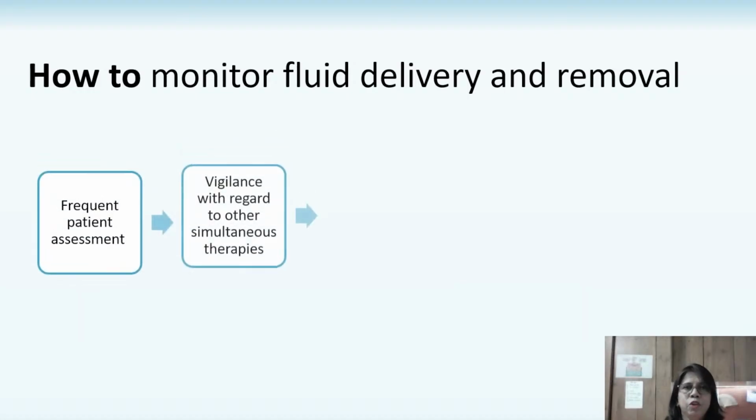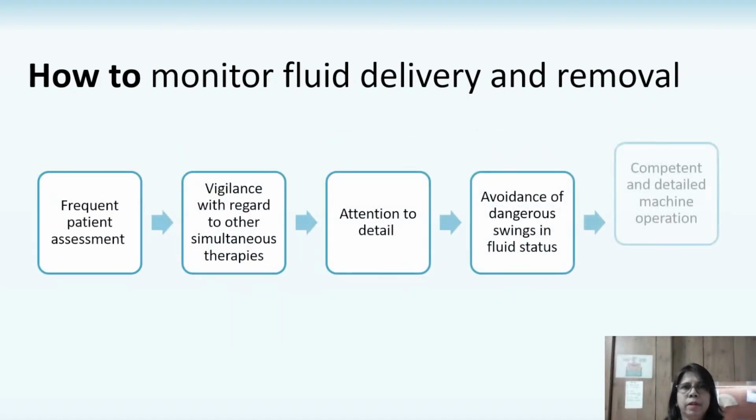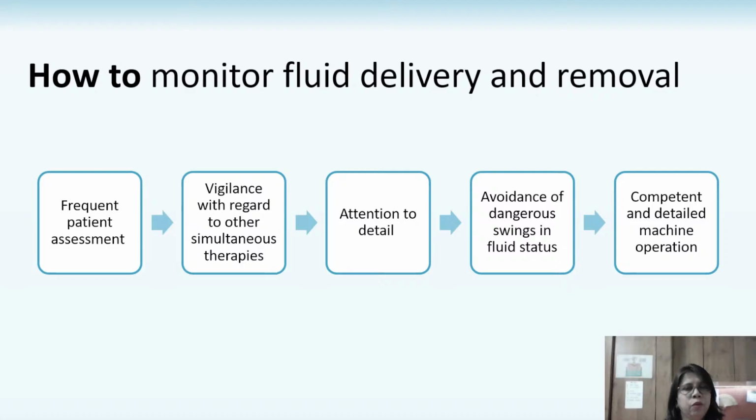So how do we ensure that fluid delivery is being monitored and the removal is being accurately done? First of all, frequent patient assessment. Hourly charting has already been mentioned. But more vigilance related to other procedures. That is, like I said, either procedures on the patient, or the patient is being sent out for investigations, or maybe he is receiving additional nutrition supplements or fluids, changes in antibiotic therapy, and so many other things. And this is important because we must give attention to every small detail.